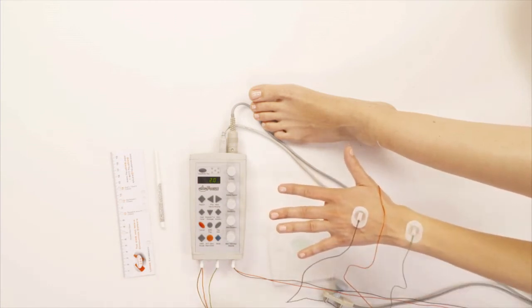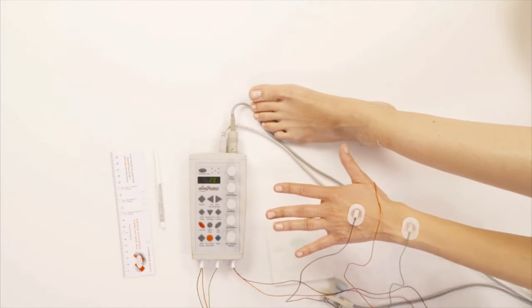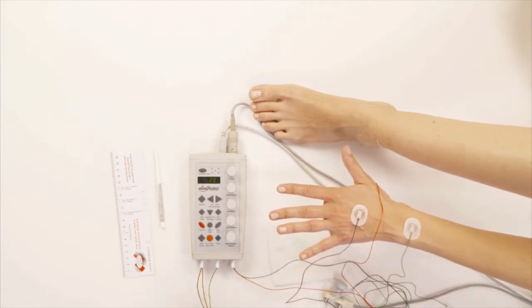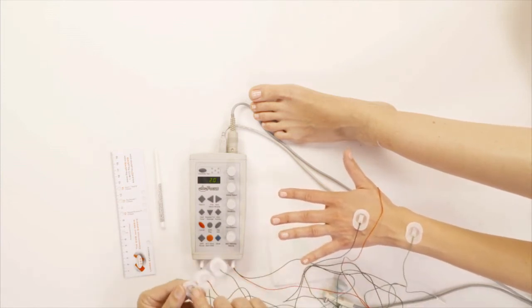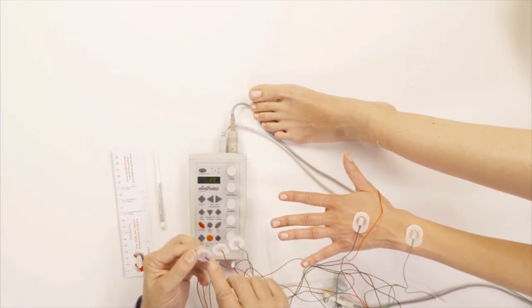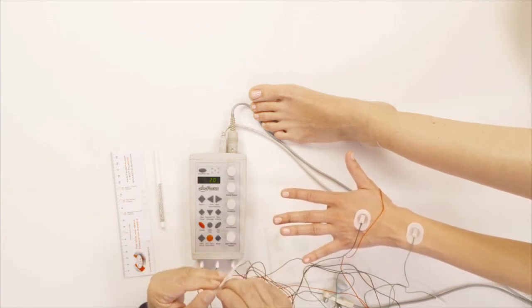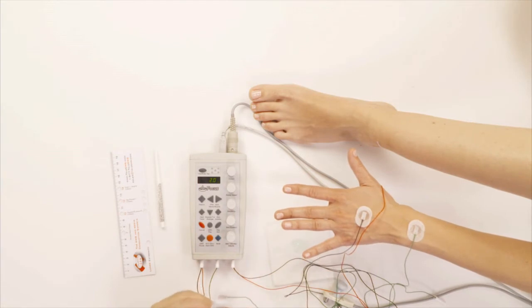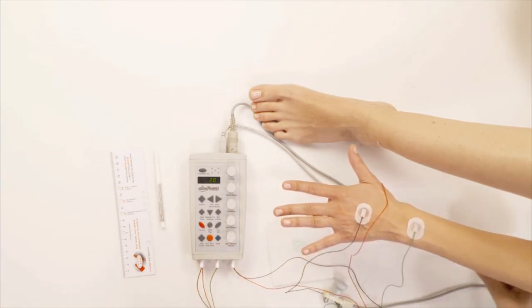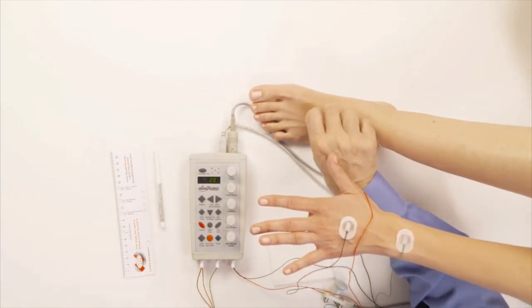So for the leg, for the foot that is, we're going to put only the black active electrode and the red reference electrode. And the black, again, is going to go over the back of the foot like so.